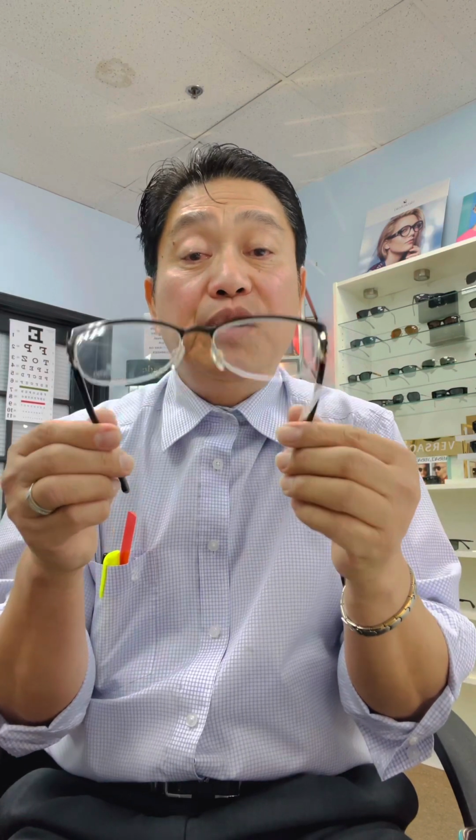semi-rimless frame. We call it a semi-rimless frame because there's no rim on the bottom here, but there's a rim on top here. This one is very nice too. The only thing with this semi-rimless one is just be more gentle with it because it's flimsier compared to a full frame. Because see this one here, there's no rim. The only thing holding your lenses from here to here is a fishing line, or a nylon wire.